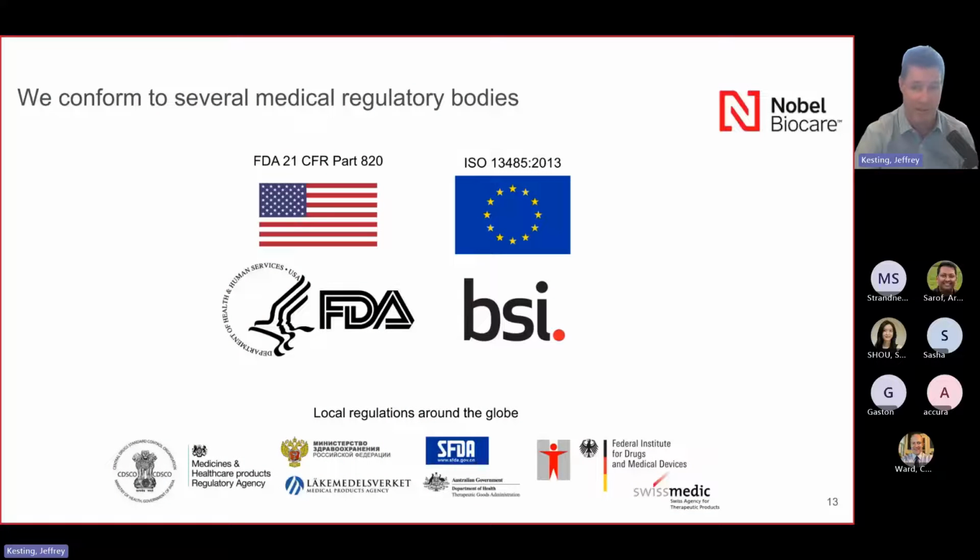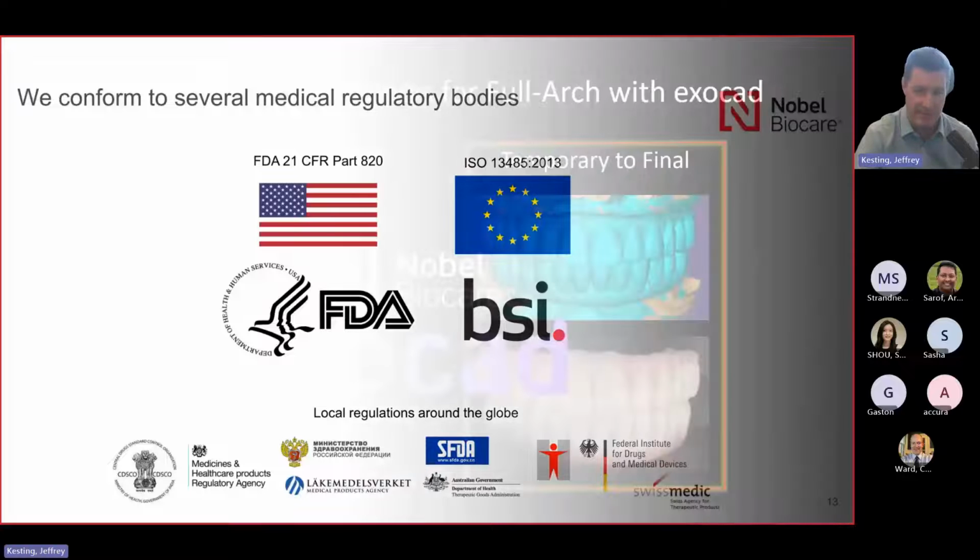And every single NobelProcera product is a certified medical device. So we adhere to all the medical regulatory bodies across the globe, of course, the FDA, the BSI, and we're regularly audited by these organizations and usually pass with flying colors, which we're very proud of.